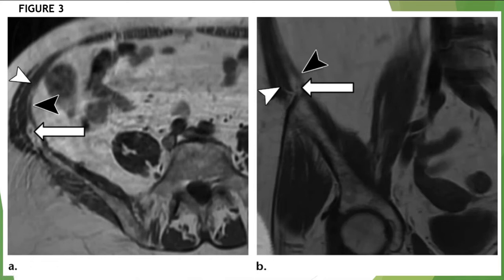Remember that this is one of the applications that needs dexamethasone rather than the other crystalline steroids, because it's a superficial nerve, and yeah, we need to avoid the skin adverse effects. So here you also have the same image from a coronal point of view. You have the nerve and the mentioned muscles there.